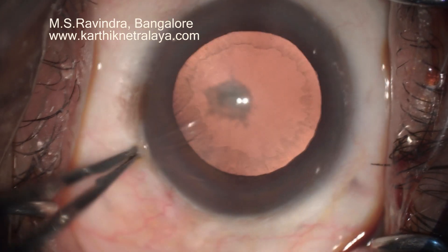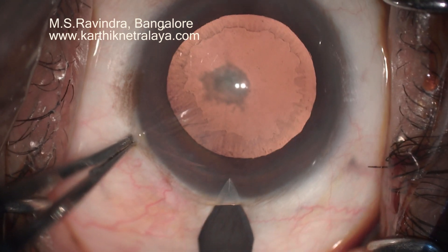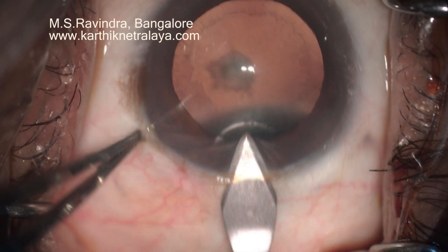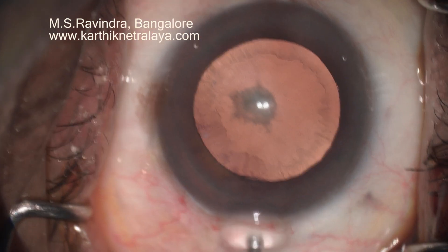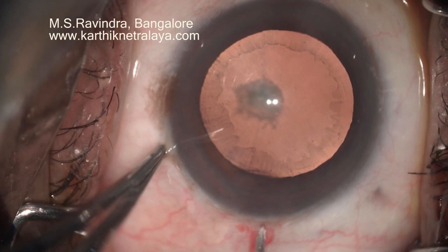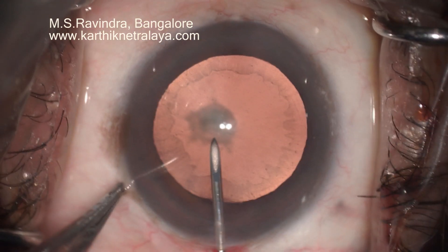A posterior subcapsular cataract. You can see the pseudo-exfoliation in this eye; there is no glaucoma. A 2.8 mm translimbal keratotomy, a little longer than usual, starts from the anterior most clearer cornea, and there is a small frill of conjunctiva left in the tunnel entry area.